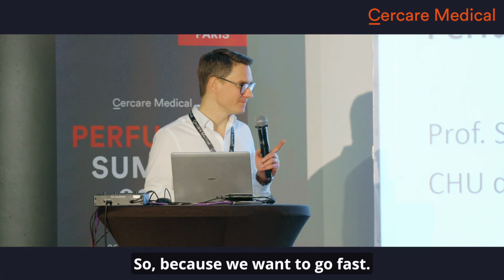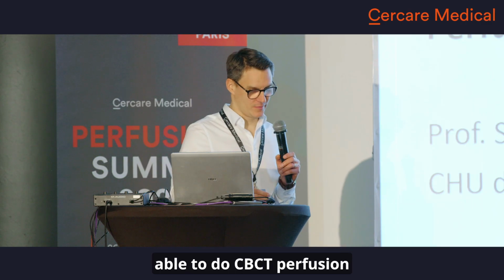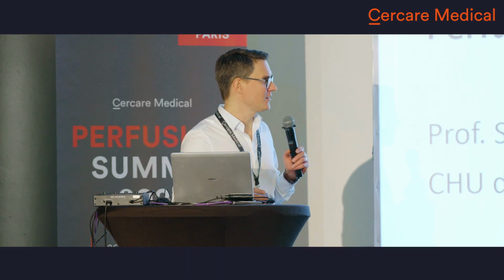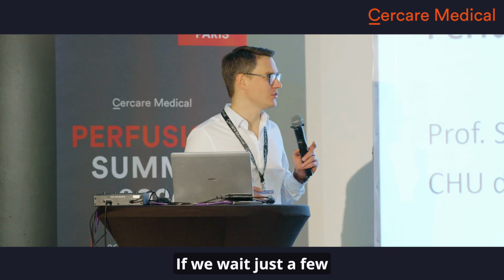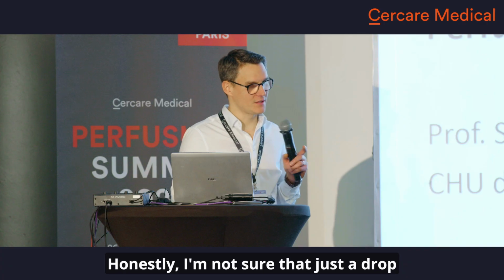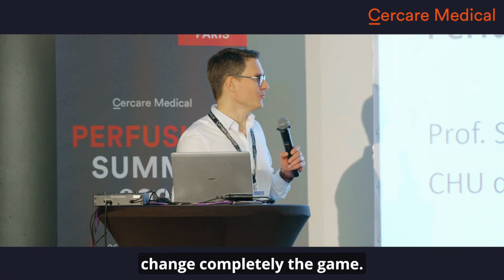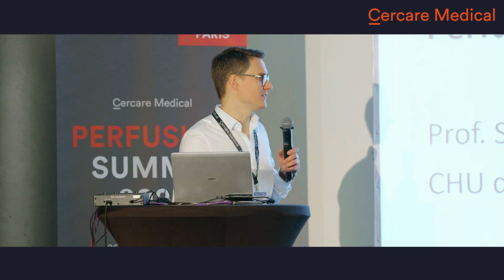Yeah, because we want to go fast. So sometimes if we are able to do CBCT perfusion 1 or 2 minutes after the anesthesia, we may witness this kind of problem. If we wait just a few minutes, it's too late. And honestly, I'm not sure that just a drop of the blood pressure for a few minutes will change completely the game. Honestly, I don't believe this.